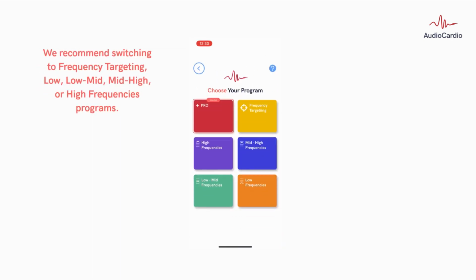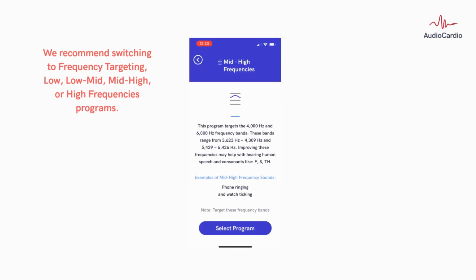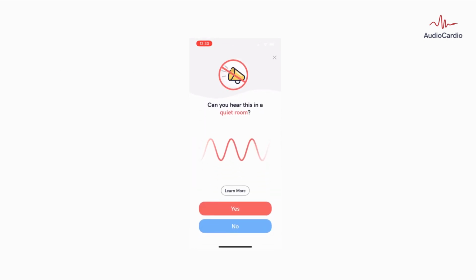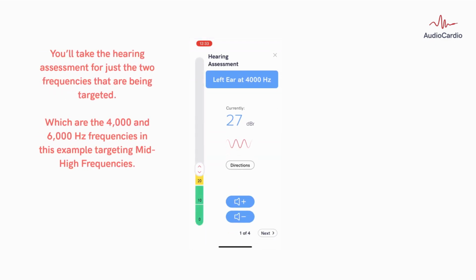We recommend switching to frequency targeting, low, low-mid, mid-high, or high frequencies programs. For this example, we're going to select the mid-high frequencies program. You'll take the hearing assessment for just the two frequencies that are being targeted, which are the 4000 and 6000 Hz frequencies in this example targeting mid-high frequencies.